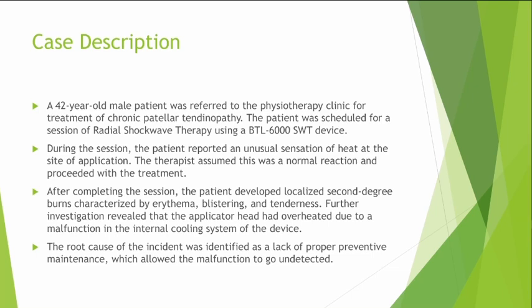The therapist didn't check this device. They didn't pay attention when the patient reported an unusual sensation, and they assumed that it's just a normal sensation, normal because of this device, but it's not actually. It just let the patient develop a localized second-degree burn.